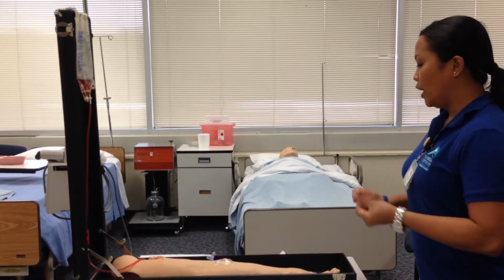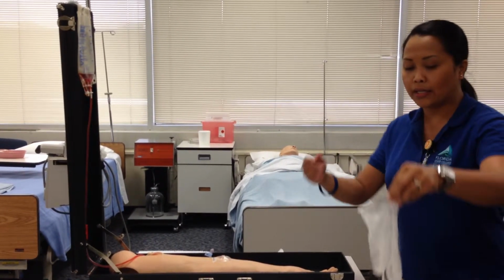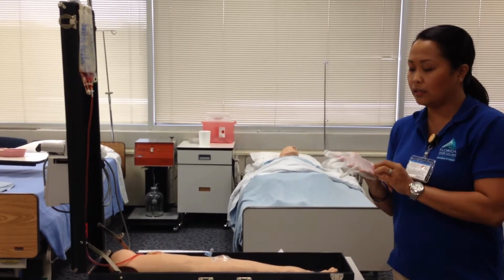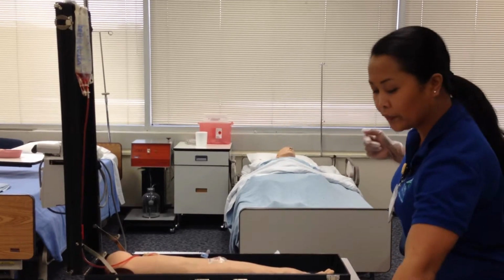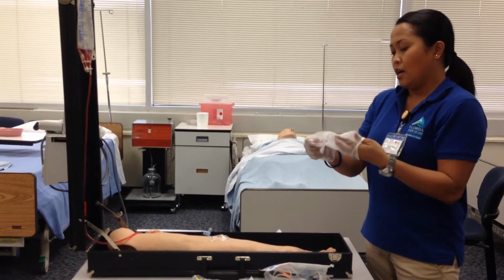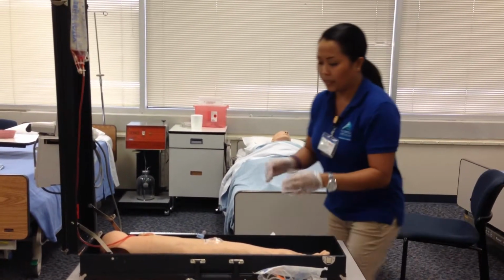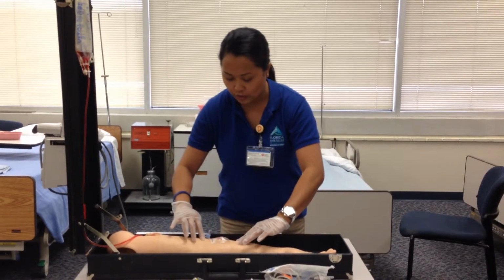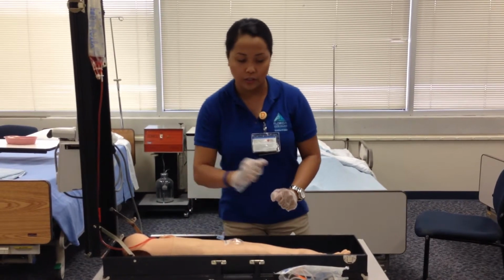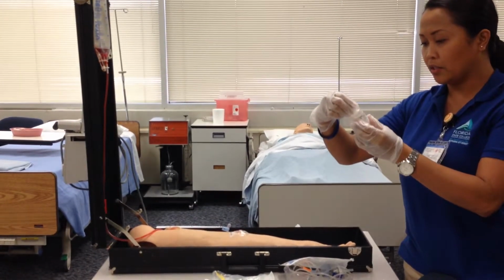Done with that, and then I'm going to wash my hands, cleaning my hands, because I'm going to inspect the site of the first IV line that I gave earlier this morning. So I'm putting my gloves on, making sure everything is clean. All right, gloves are on. Here we go, and then I'm going to pop it and make sure the IV site is good. There's no inflammation. There's nothing bad going on around here. Everything's good.